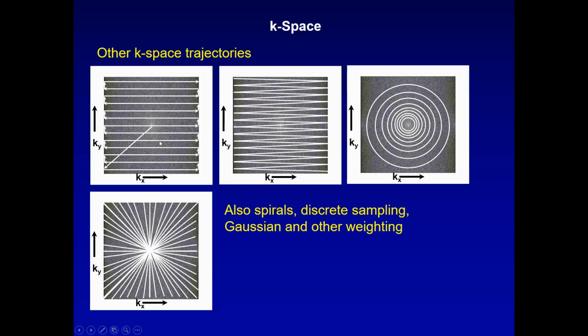If you were trying to run a race with an old Cadillac, maybe a great big car, very comfortable, could be a powerful engine, it's not going to make those curves so well. And in that case, you want some trajectory that's going to be more gentle, like the circular or a spiral. Each trajectory has its own demands for reconstruction, for converting the time domain or k-space domain data into an image. And each one has robustness with regard to certain kinds of samples.